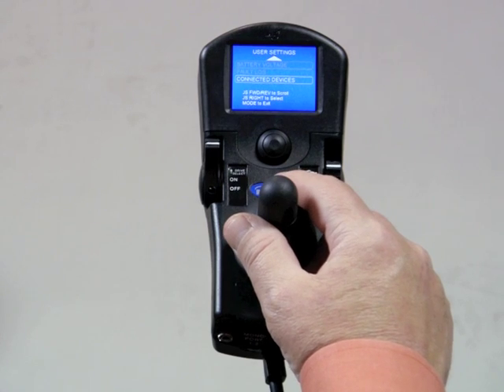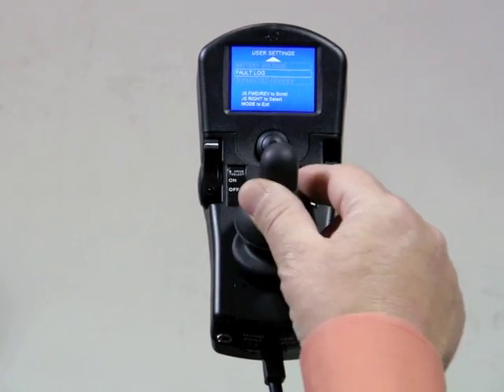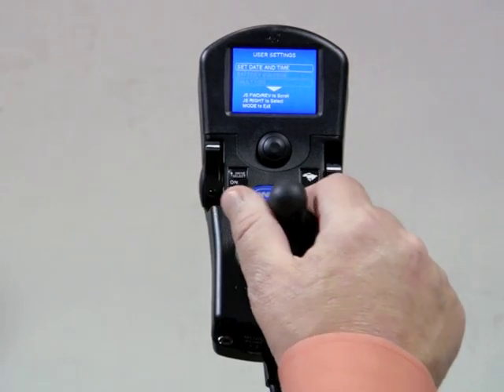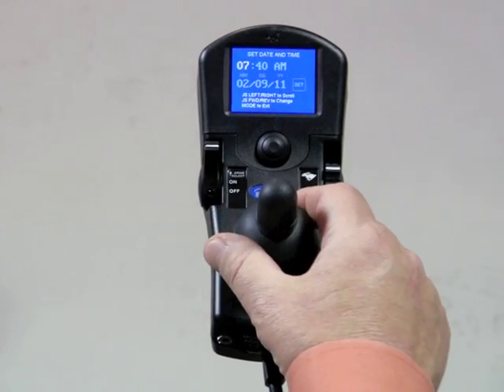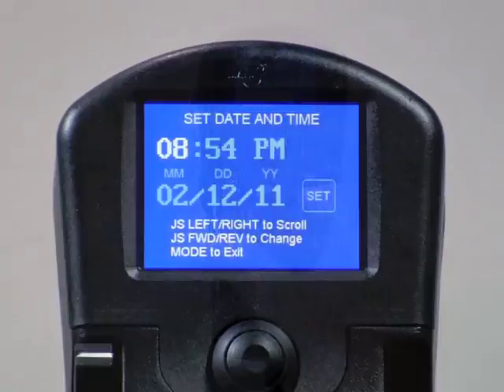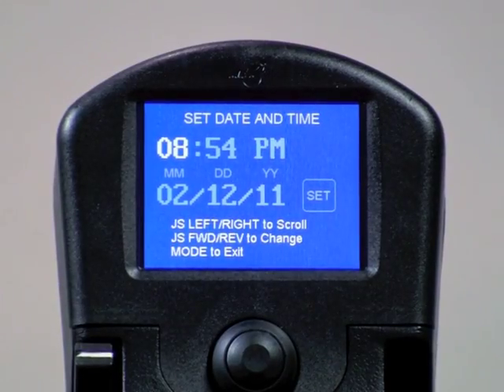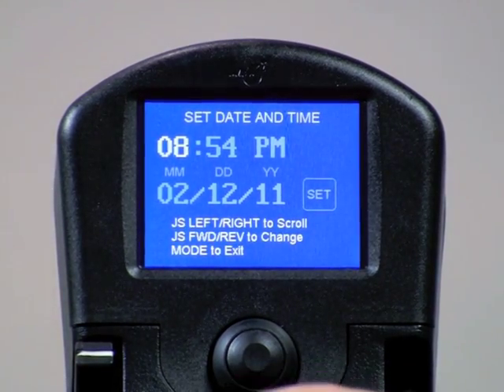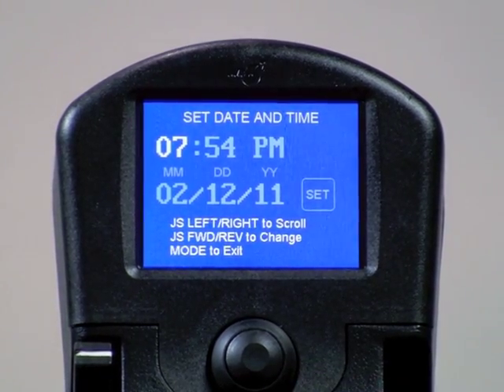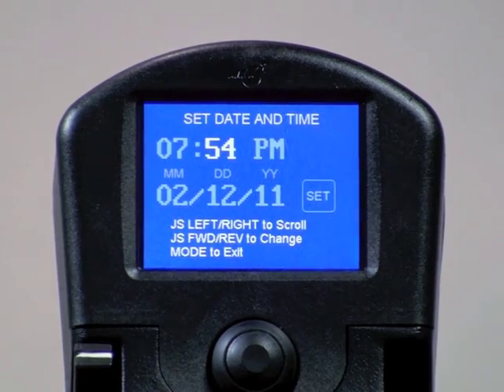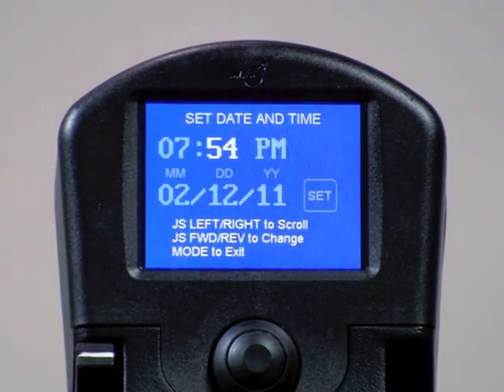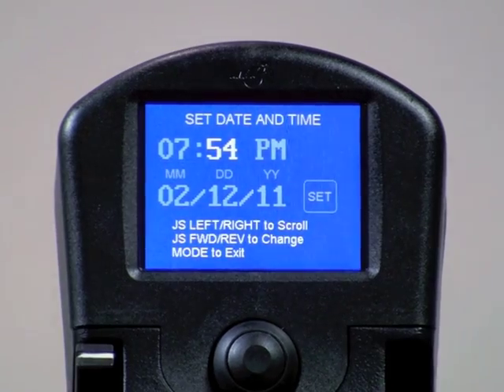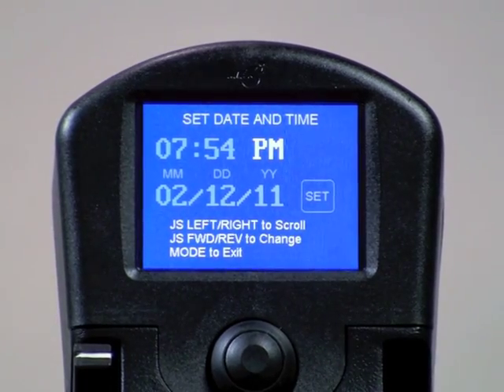To set the date and the time, first use a forward driver command to highlight this field, then a right command to enter it. In each field, forward and reverse driver commands will change each setting. A right command will advance to the next field. Move through the hour, the minutes, and be sure to set AM or PM.